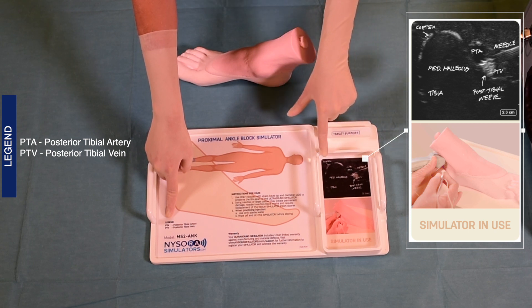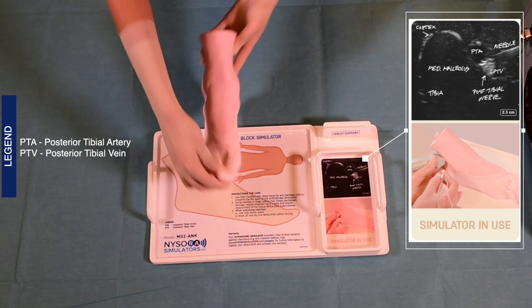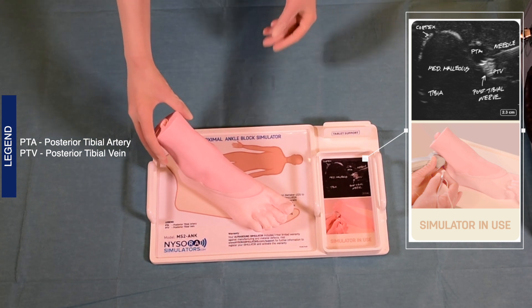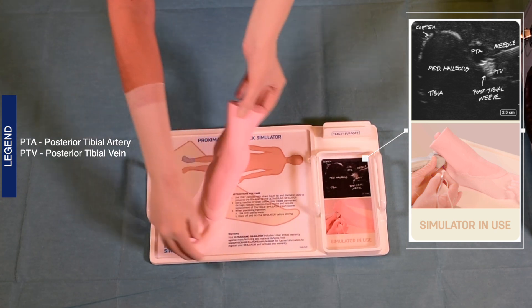To begin practicing the ankle block, increase the gain on the ultrasound machine. This is necessary because the sonographic characteristics of the simulators are different than that of normal human tissue. Therefore, more gain is required in order to obtain the best images.